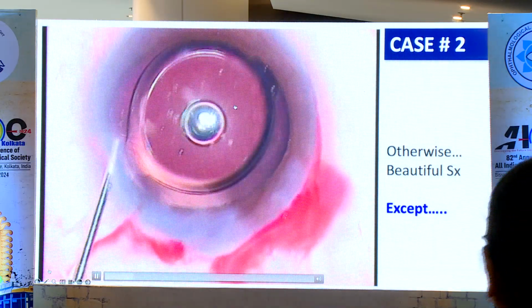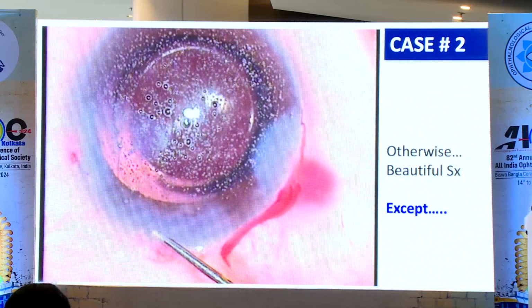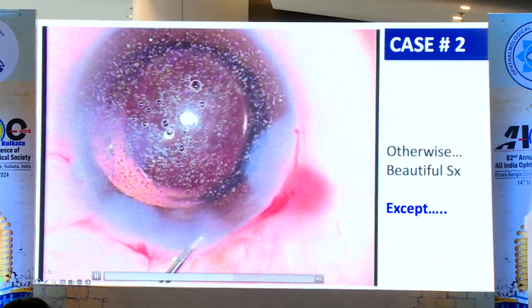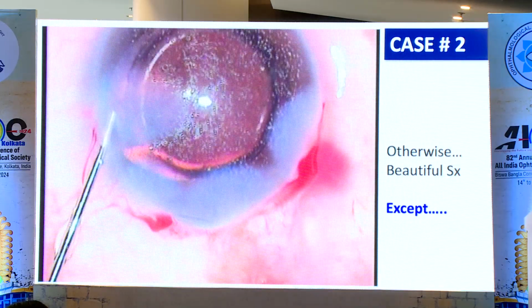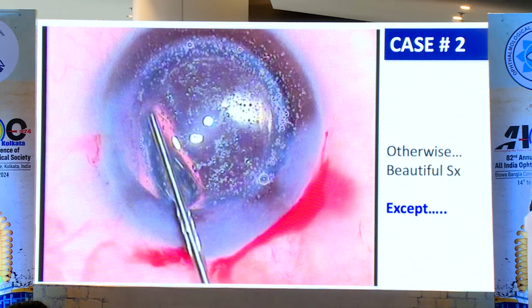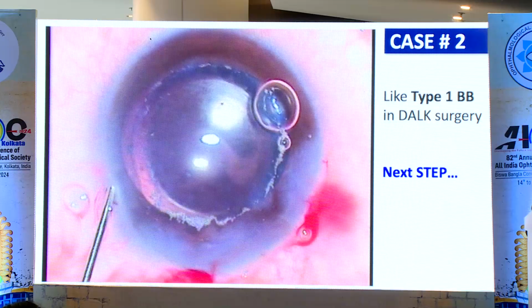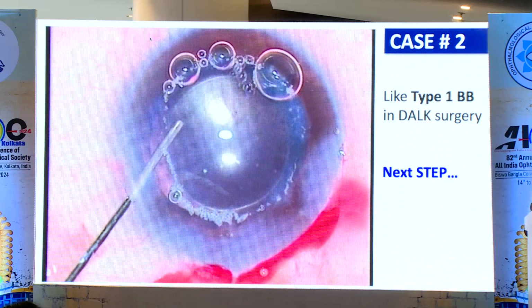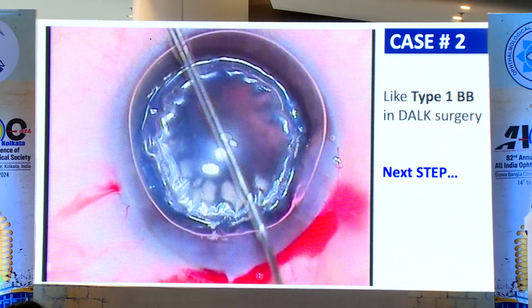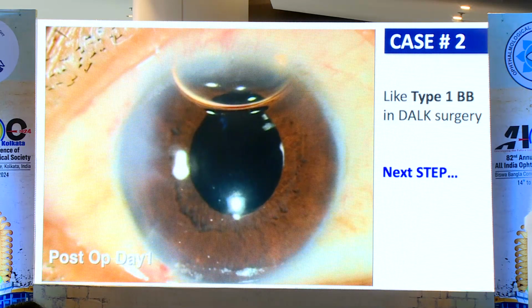Just observe this case, where I made a mistake. When I hydrated the second port, there was probably a Descemet detachment here, but I missed it. Again I went for hydration, kept hydrating, and I just missed the Descemet detachment. So when you miss the earliest sign of Descemet detachment and keep injecting fluid, it will increase. What to do? The next step, I identified it in the OT, and then I put air. Understand that the air bubble should not go within the cornea. This is a very important step.